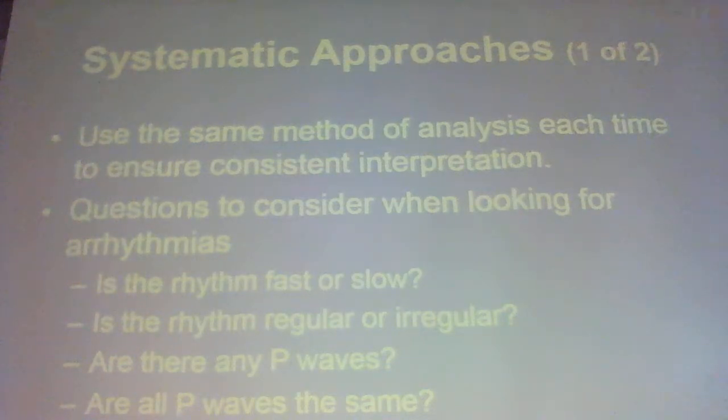So if they have the same name, they're anatomically contiguous. And if they're numerically sequential V leads, they're anatomically contiguous. So even though V1 and V2 are septal, V3 and V4 are anterior, if I had V2 and V3, that is significant because they are numerically sequential. Make sense?